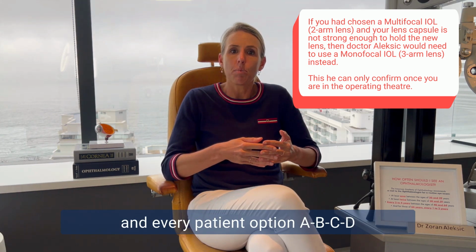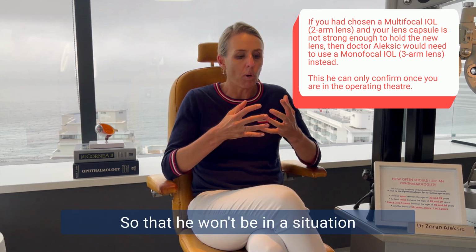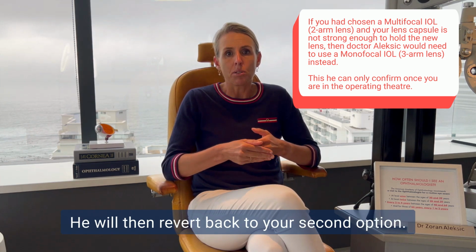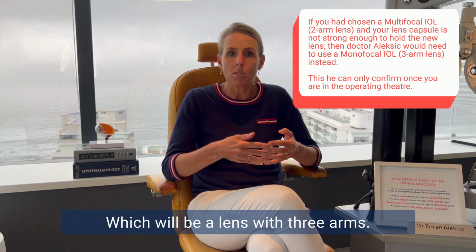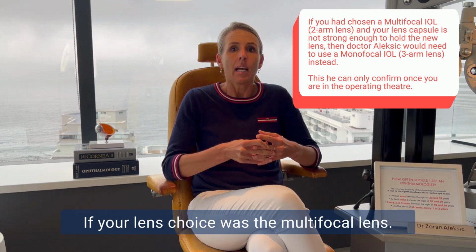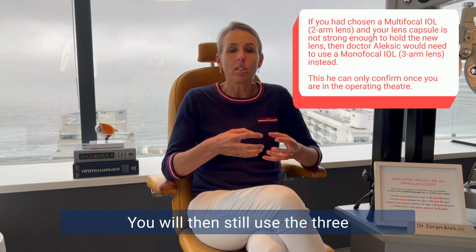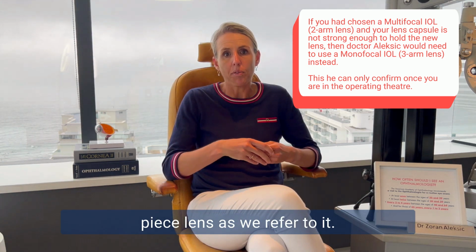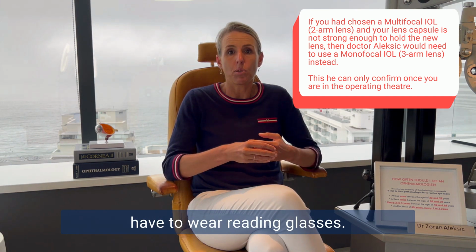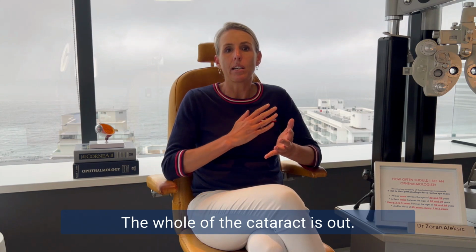Now, doctor takes for each and every patient option A, B, C, D in terms of lenses to theatre, so that he won't be in a situation where there is nothing for him to use. He will then revert back to your second option, which will be a lens with 3 arms. If your lens choice was the multifocal lens, we will then not be able to implant the multifocal lens. You will then still use the 3-piece lens, as we refer to it, and that will be in order to correct your distance vision, in which case you will still have to wear reading glasses. But let's assume you have a good, strong capsule, the whole of the cataract is out.